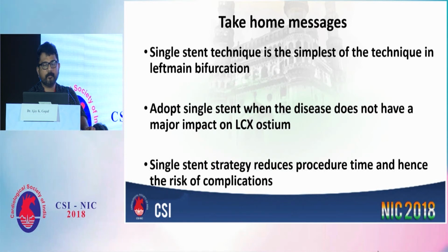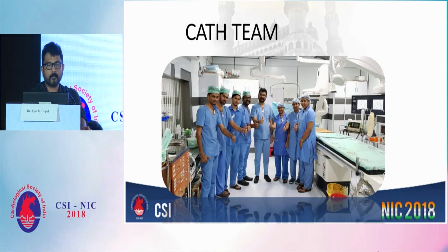So single stent is the simplest of the techniques, and we can adopt a single stent when there is no major impact on the LCX ostium, as in this case the size is less than 2 mm. The ostium of the circumflex was not involved, and it was non-dominant. Thank you.